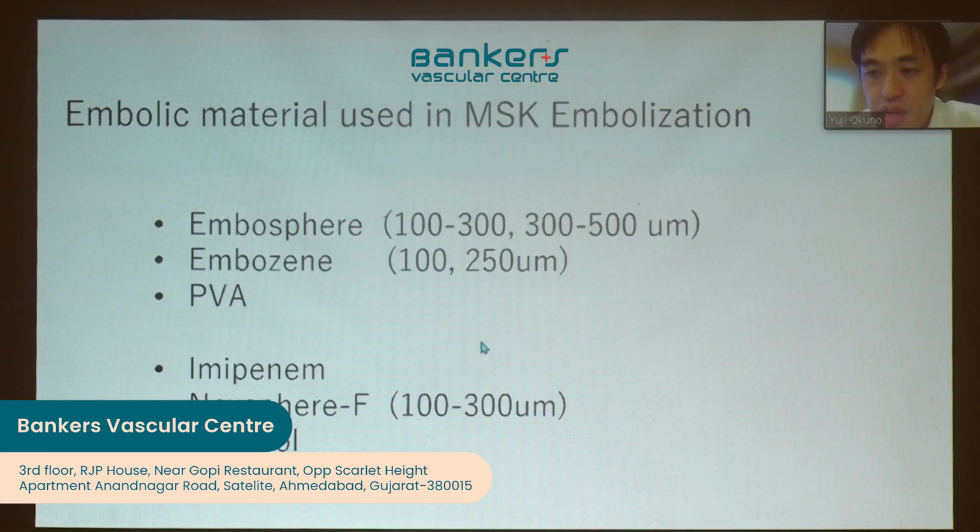Next, I will talk about embolic material used in the TAME procedure. We have several types of embolic material. First is the permanent microsphere. Permanent microspheres remain inside the blood vessels for a long time, 2 or 3 months, so we call it Embosphere or Embozene. PVA is also a relatively long-lasting permanent microsphere.